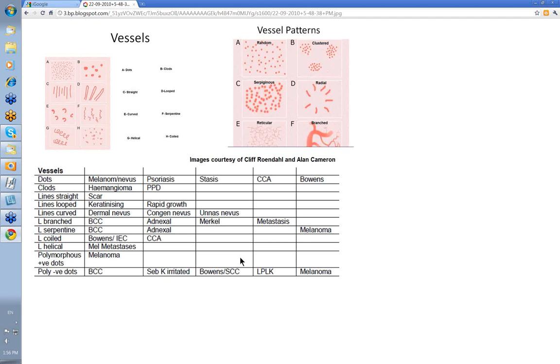This table attempts to put together the vessels with the common pattern they have. Dot vessels are quite good for melanoma and nevus, but they're also a feature of psoriasis, stasis in the lower legs, clear cell acanthoma, and sometimes Bowen's where the coils look like dots. Clods you'll see in hemangiomas and pigmented purpuric dermatosis. Vessels as straight lines you'll see in scars — quite a good one to know.